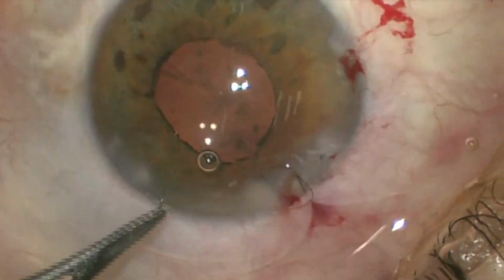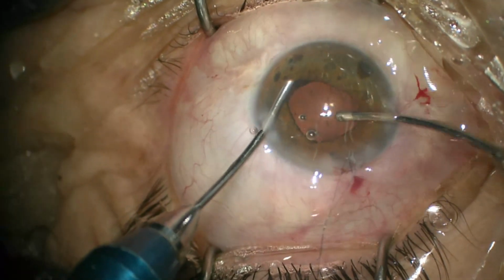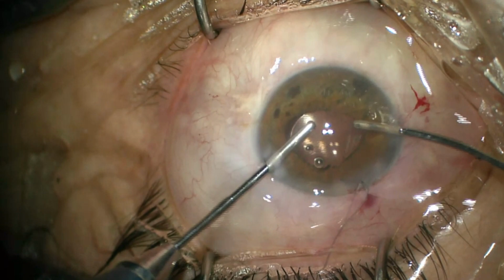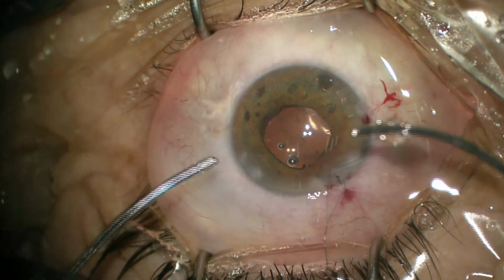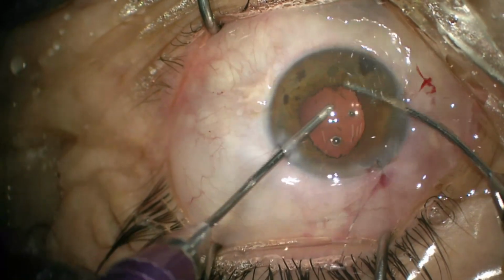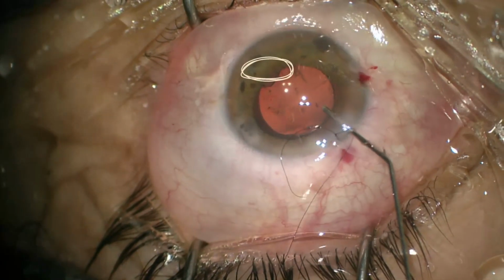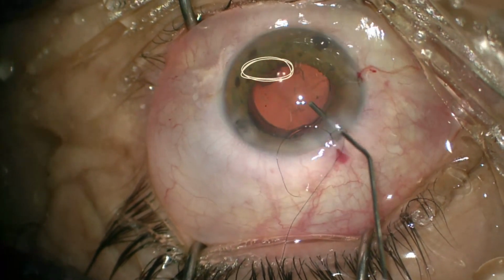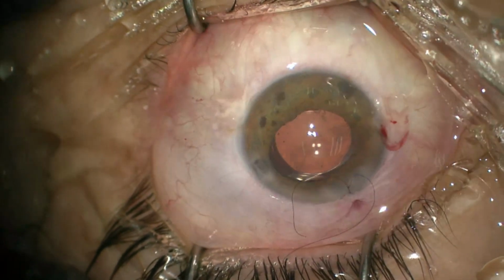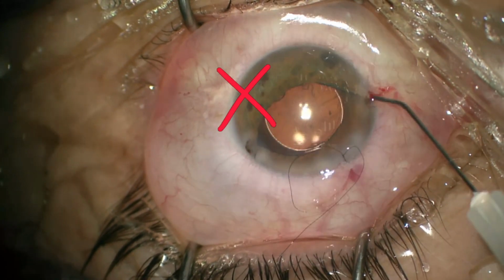Closing temporarily the main incision will help to maintain stability. This is another option. Look, there is still a small amount of cortex in the inferior periphery, and even though you have good stability, the iris won't let you go much further, even going behind the IOL. You can flush again with the BSS cannula. Yeah, that's the piece inferiorly, but again, too much flush will put the iris out again.